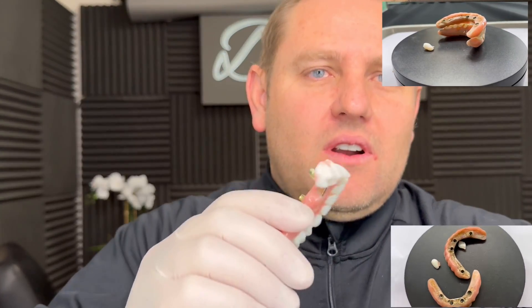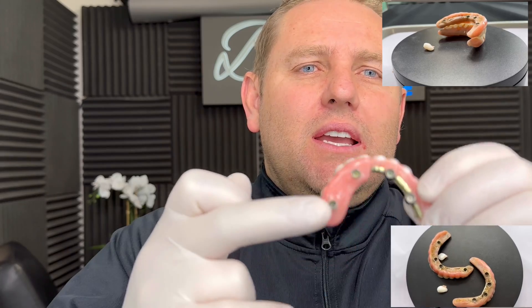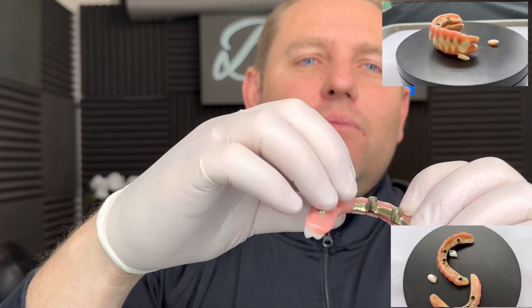So that's exactly what she has inside here. We don't have a problem with the bar. This is called a polylithic device — polylithic meaning that it's made up of three different items: ceramic teeth, acrylic, and a titanium bar.